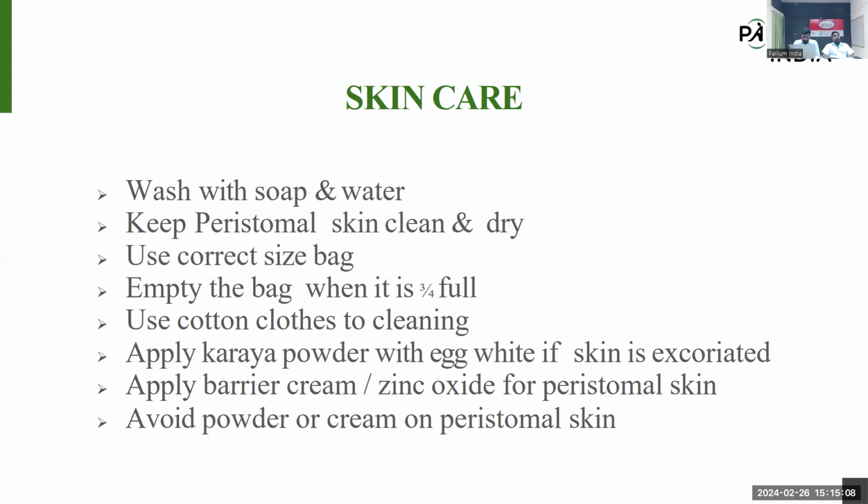Then after fixing the bag, whenever the bag is half full, or maximum three-fourths full with fecal matter, at that time we need to empty the bag, or otherwise it will cause the overflow of the bag. That overflowed fecal matter or secretion will get in contact with the peristomal region. So that's important. Three-fourths is the maximum quantity. Then for cleaning, use only cotton cloths because that is the only skin-friendly material. These are all the things we can do for the prevention of skin excoriation.